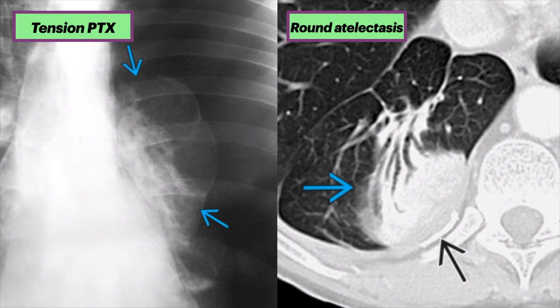Here are some pleural abnormalities causing atelectasis. The left chest x-ray in this patient with acute chest pain and shortness of breath shows a large left tension pneumothorax, producing marked left lung atelectasis and mass effect on the mediastinum. The case on the right is round atelectasis. The axial CT in this patient with asbestos-related pleural disease shows bilateral lower lobe rounded atelectasis exhibiting the comet tail sign, characterized by the curvilinear morphology of the bronchovascular bundles. Note the adjacent calcified pleural plaques seen by the black arrow.